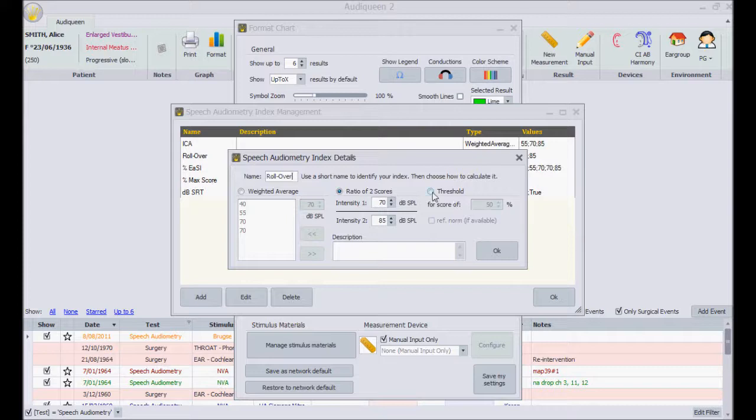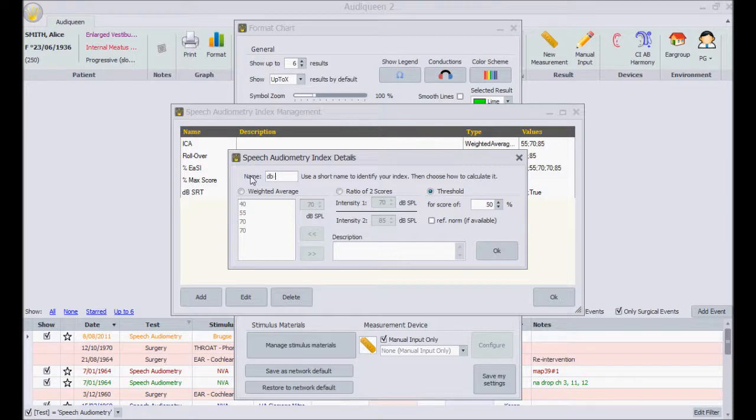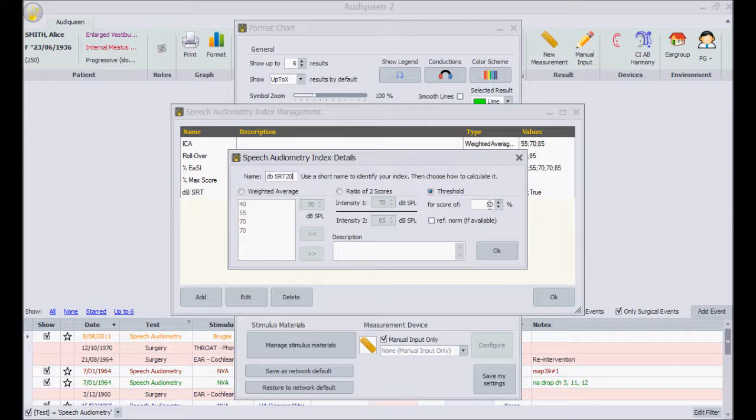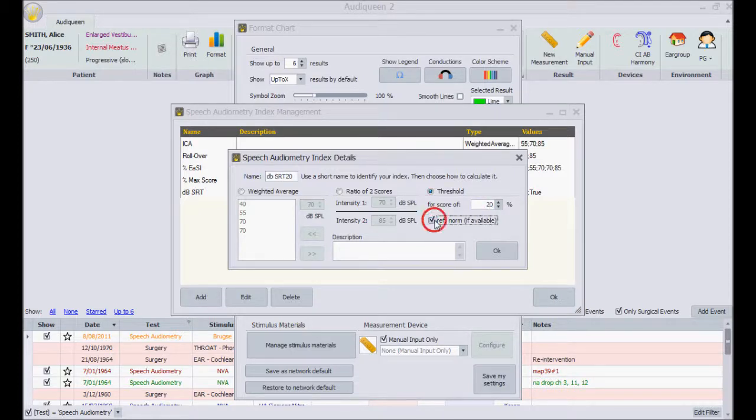And finally, an index can be defined as threshold, corresponding to the presentation level which gives a score of 50%, or any different score I'd like to use for it. Audi Queen calculates this as the absolute level, or relative to the normal curve that comes with the speech list.